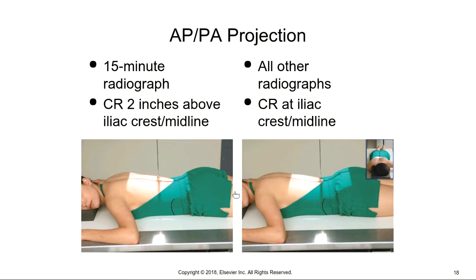And then every other image, they're actually at the crest and aligned with the spine. This is again on page 513. Typically with this, you will probably get a diaphragm on this, and the respiration is on exhalation, right? Because we're on abdomen, so all abdomen is on exhalation. And ideally, we want to use a left marker if at all possible.